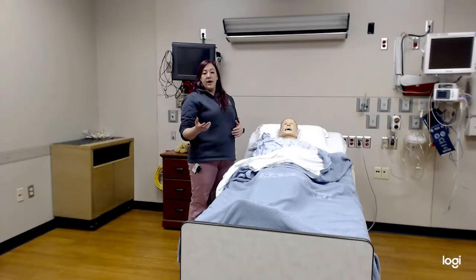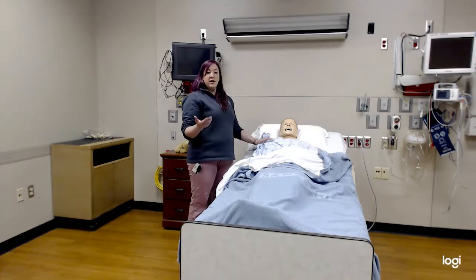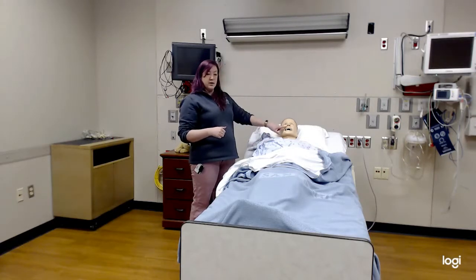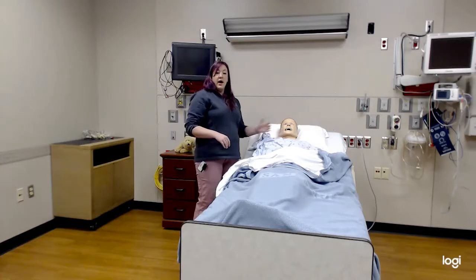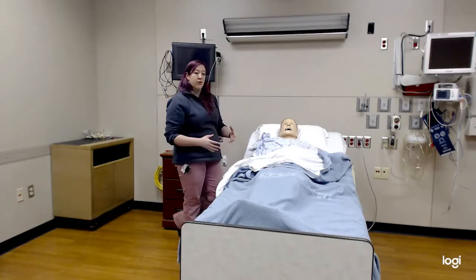The other thing with airway is, can they maintain it themselves? If they're alert, if they're at least at verbal, chances are they can probably maintain it themselves, and I don't need to insert an airway adjunct. With painful stimuli or with unresponsive, I'm going to need to insert an airway adjunct. With painful, if they're still alert to painful, I'm probably going to want to insert an NPA, so through the nose. If they're unresponsive completely, I can see if they'll take an oral adjunct, and I would want to insert it at this point.